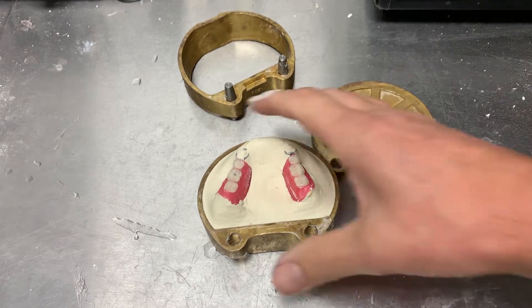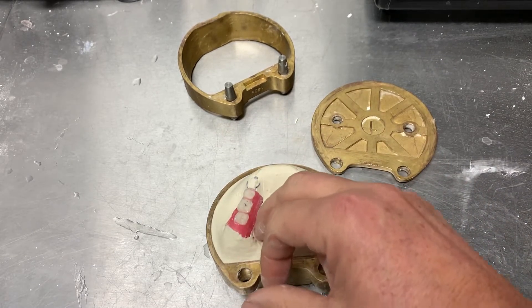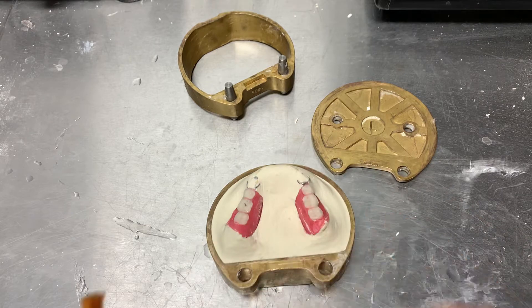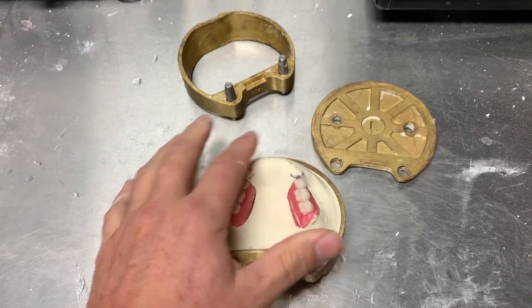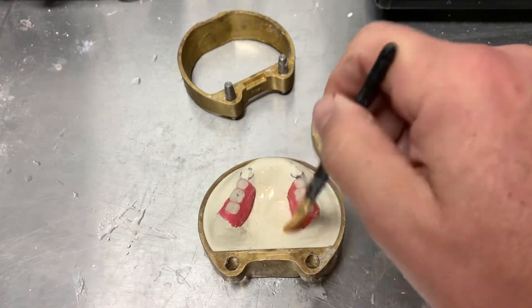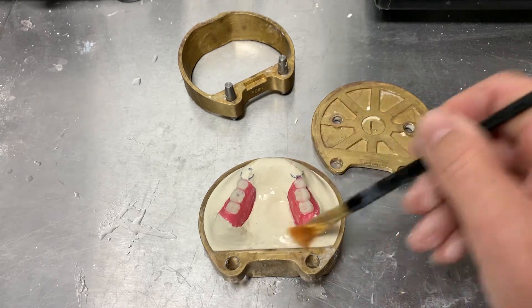The first layer has set. I've smoothed the gypsum material here and made sure there are no undercuts. A tiny bit of the teeth in the framework came through — that's not an issue as long as there are no undercuts for the two layers to adhere to each other.